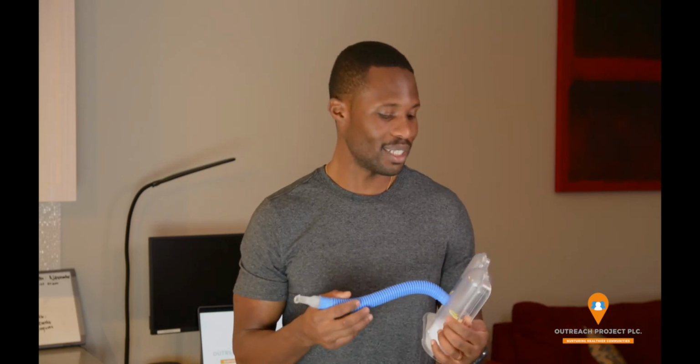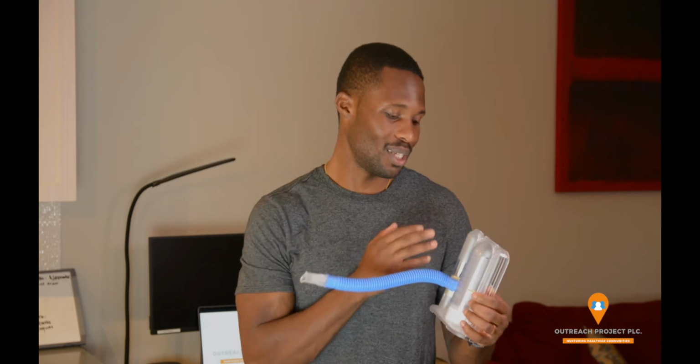You just had a very efficient and effective treatment using the incentive spirometer. But if you're not doing that currently, if it's shooting all the way up, or you're not reaching 1,500, this is a place that you can work on. Whether you're a patient or a clinician, this is a way that you can improve that.